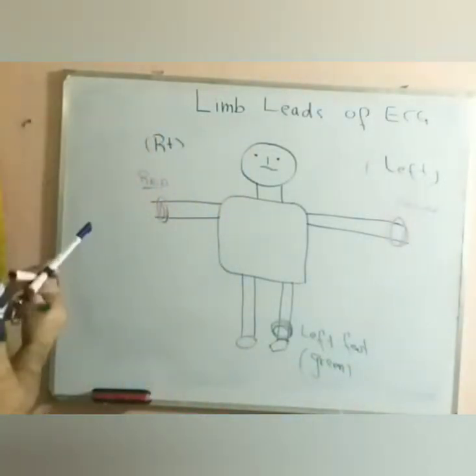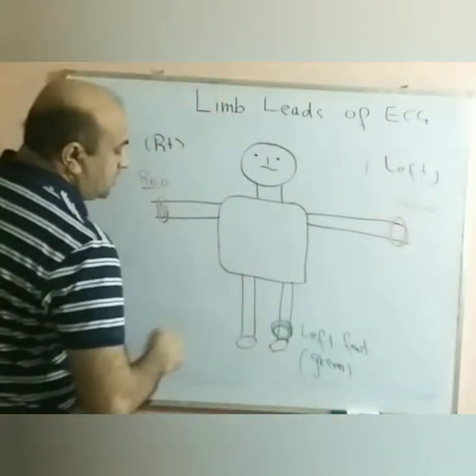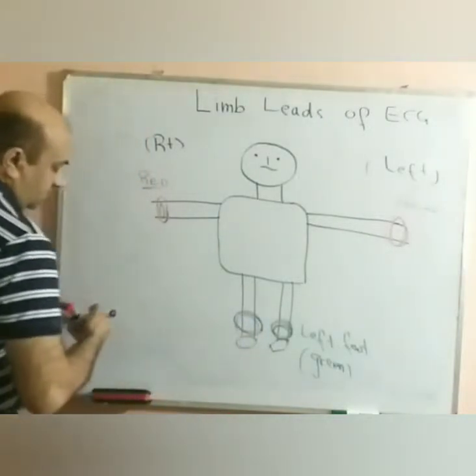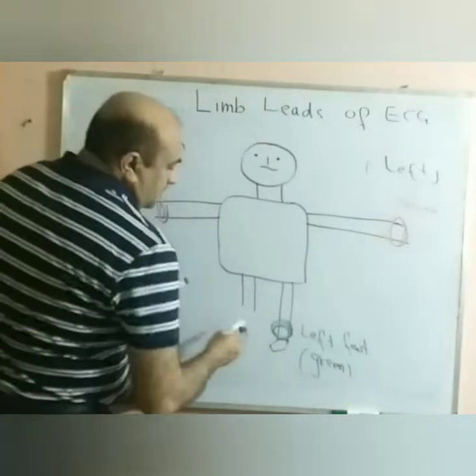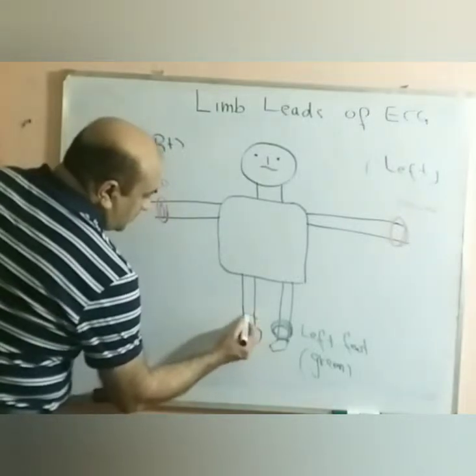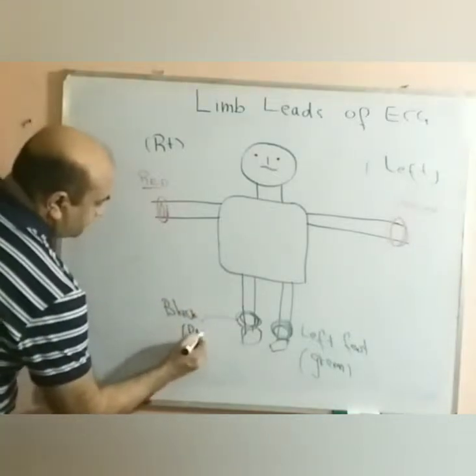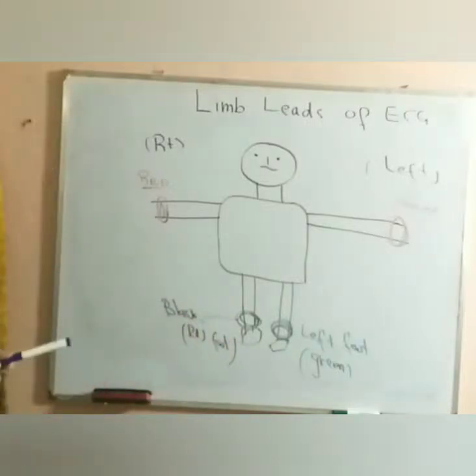And the last one was black in color, and it was placed on the right foot. This one was particularly used for ground purposes.